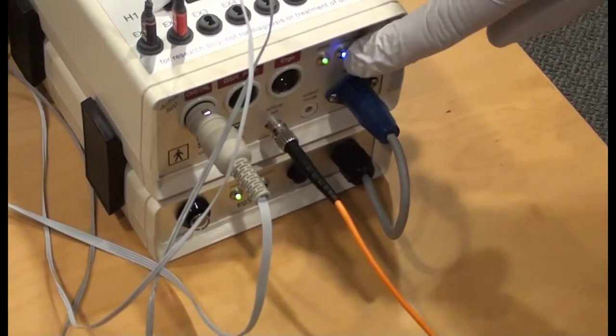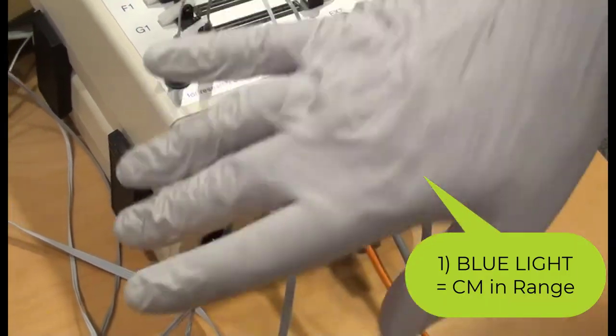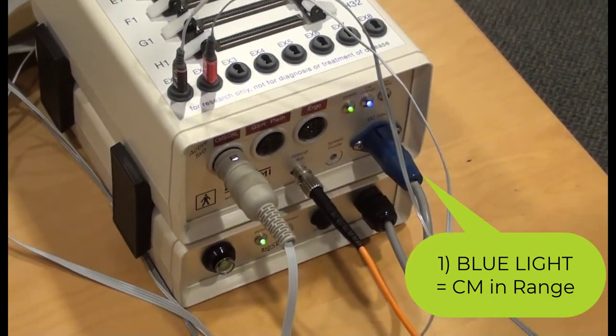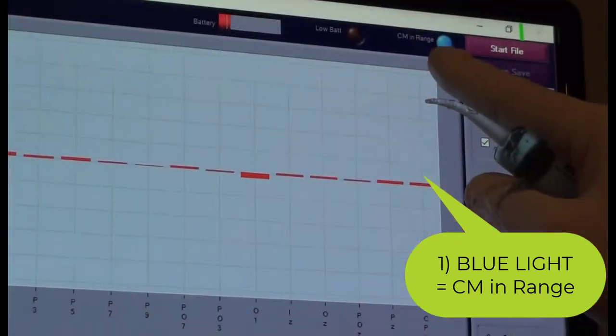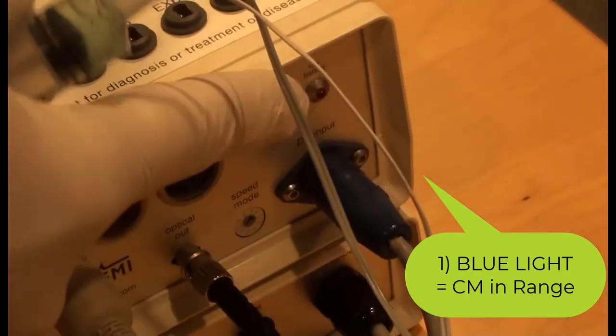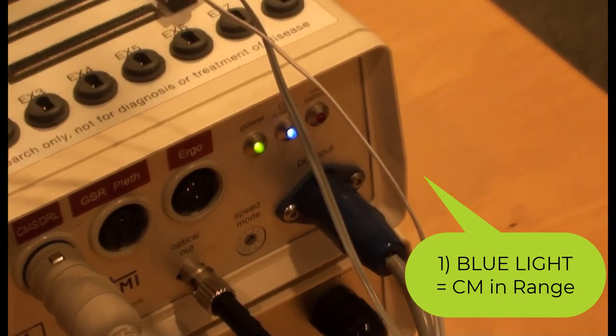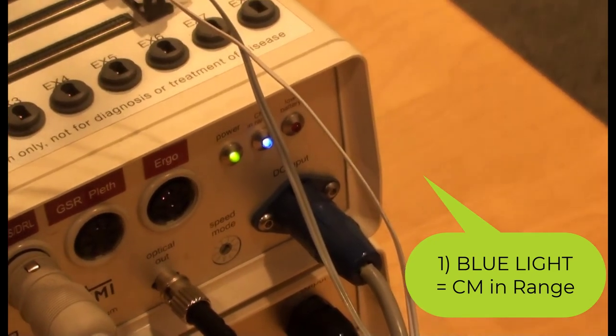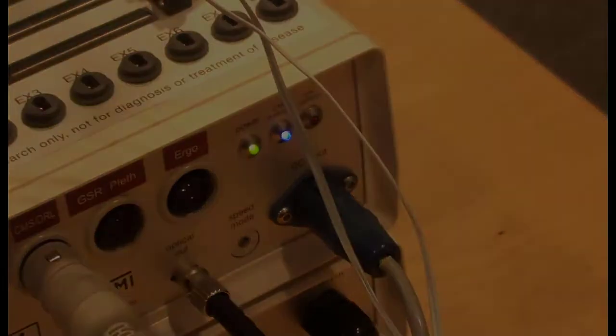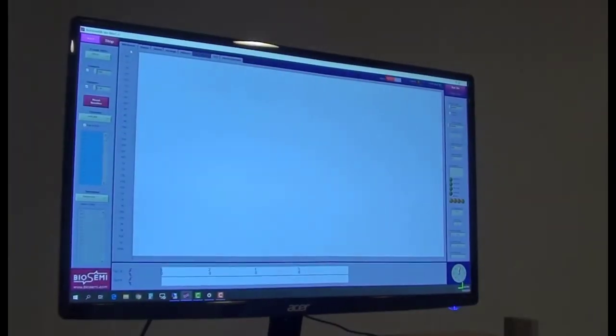When you connect CMS DRL and the AD box power is on, the blue CM in range light on the front panel should illuminate if there is a good contact at these electrode sites and there are no other faults. Be aware that the blue dot on the top right side of the ActiveView screen reflects the state of the blue CM in range light on the front panel of the AD box. Even if your data acquisition computer is in another room, you will always know the state of the blue light, even if you cannot see the AD box front panel.